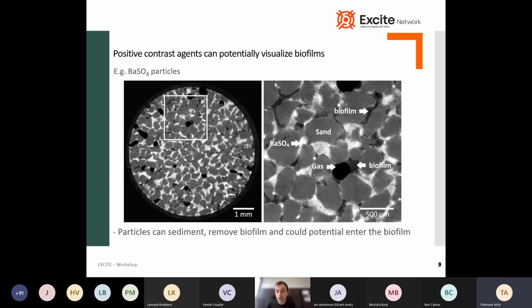Positive contrast agents were often successful in visualizing biofilms, and here I put the example of barium sulfate. What you can see on the left is a cross-section through a sand column in which bacteria grew. After bacteria were grown, I pushed out the water, let's say, and replaced it with a barium sulfate suspension. The barium sulfate is very dense, so it has very high attenuation, and you can see it as the white phases on the image. But the particles are too big to enter the biofilm, so the biofilm remains unstained. So now it's possible to distinguish the biofilm from the barium sulfate.